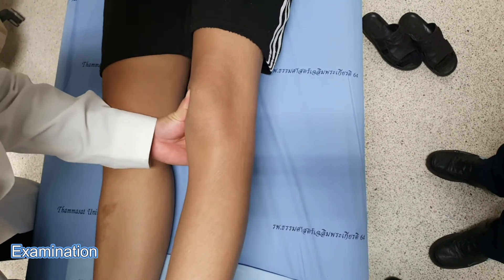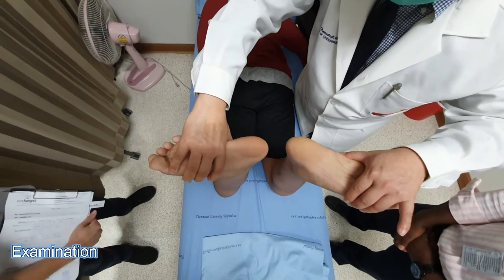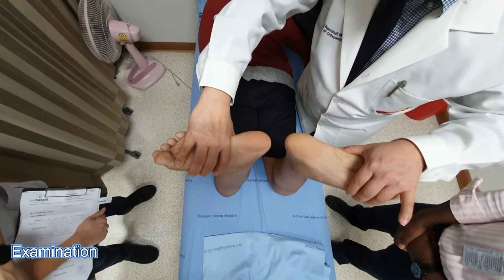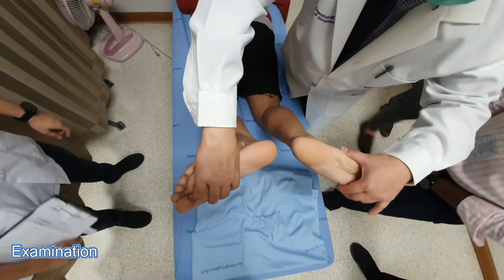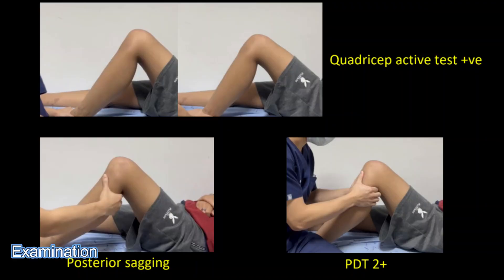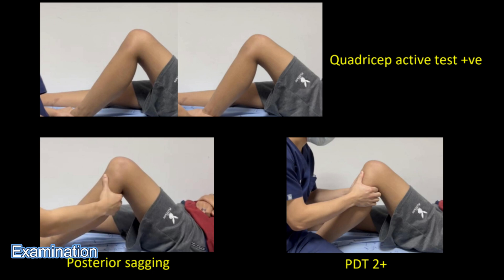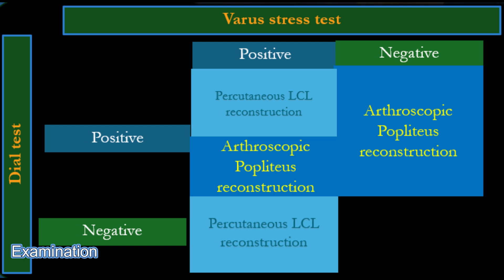Examination shows an intact varus stress test while having a positive dial test at 30 and 90 degrees. Posterior Drawer Test and Quadriceps Active Test was also positive. Based on our clinical examination, we have concluded that the patient has a PCL and Popliteal Tendon Injury and have decided for arthroscopic reconstruction.